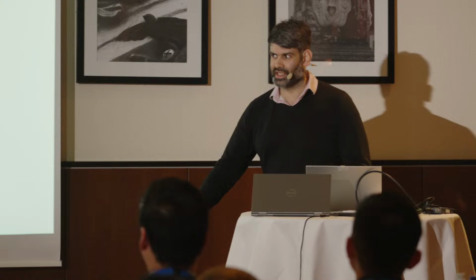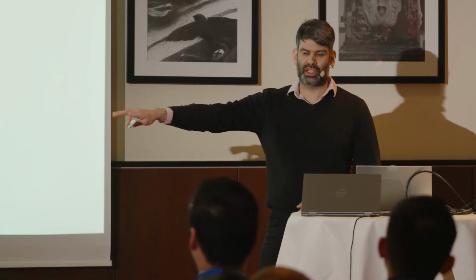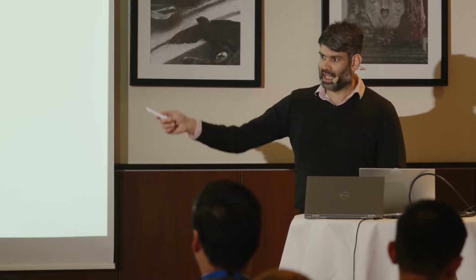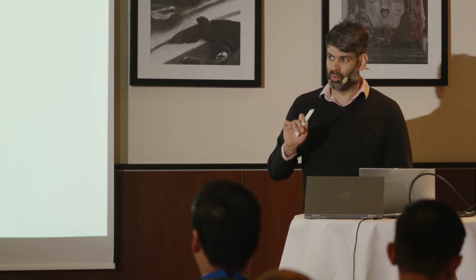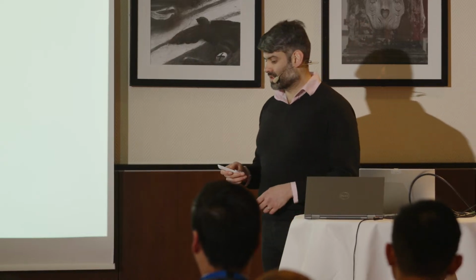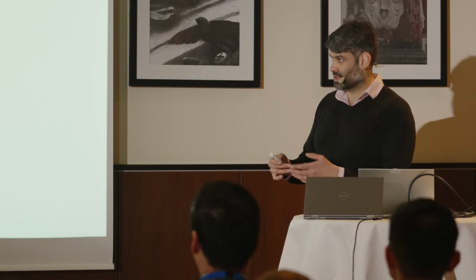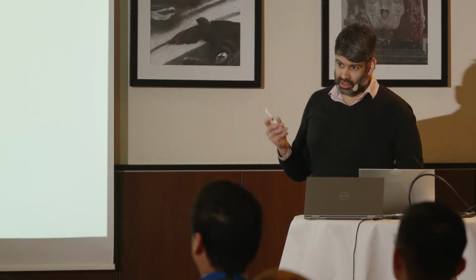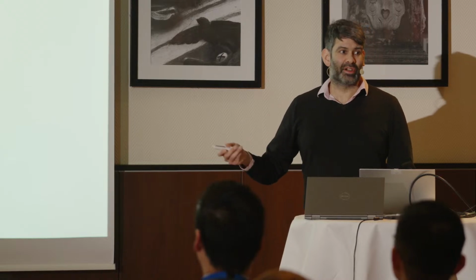So a tight lesion is here, fluorograb with the IVUS in that position, or a single digital image with the IVUS in that position, and tell our techs in the room to record what I'm seeing at that point, or I record it myself on the IVUS machine itself. Now that we've got the touchpads that we can use very close to us, just get into habits early of labeling your images as you go.